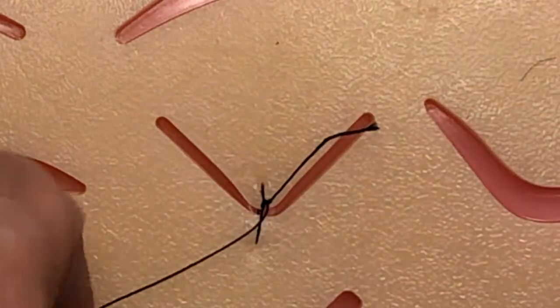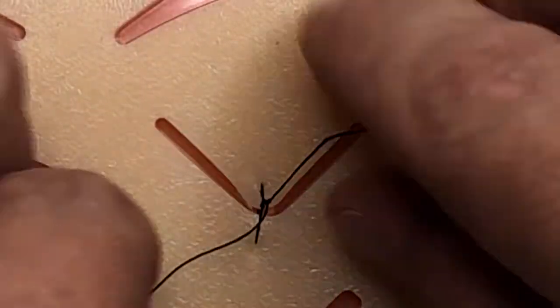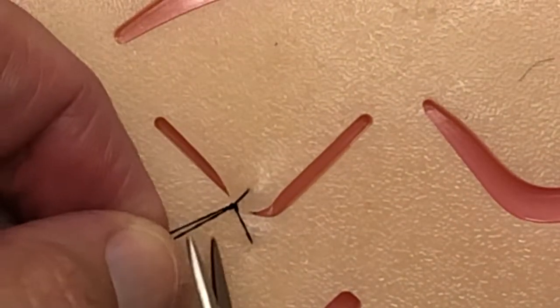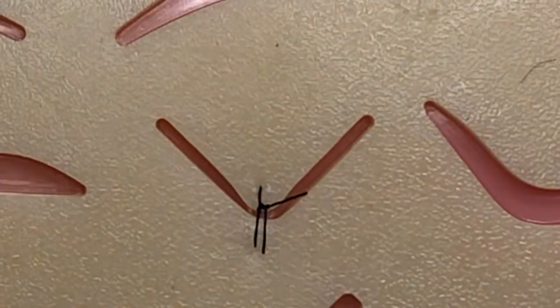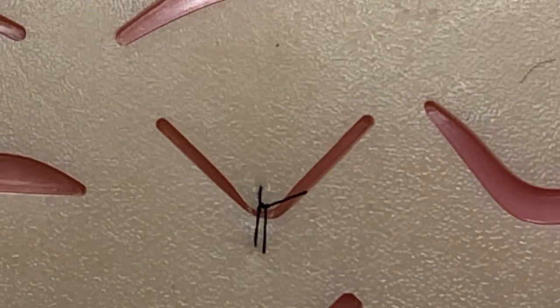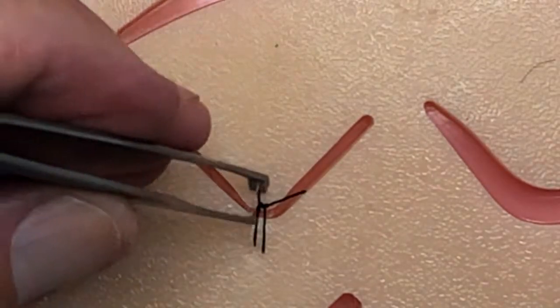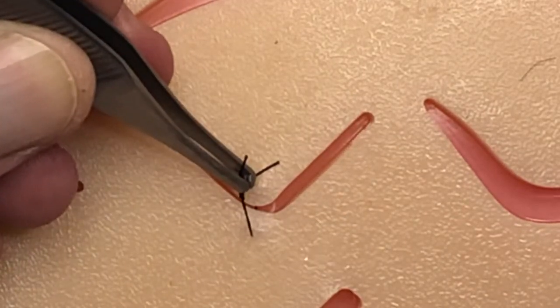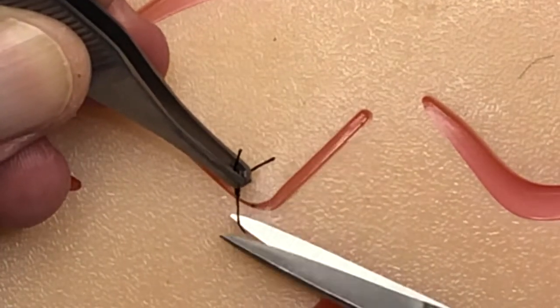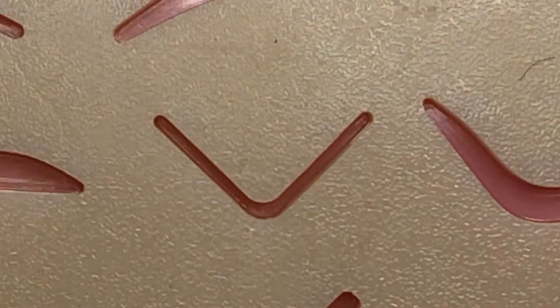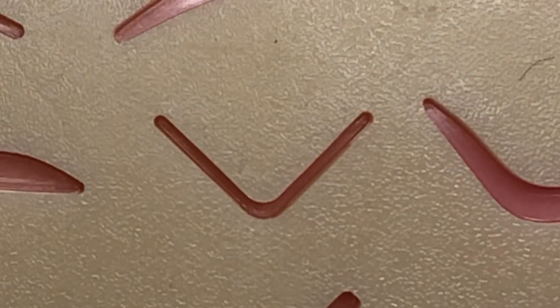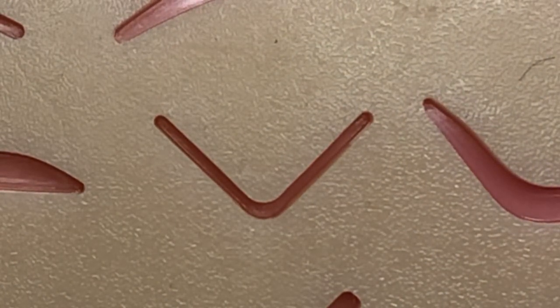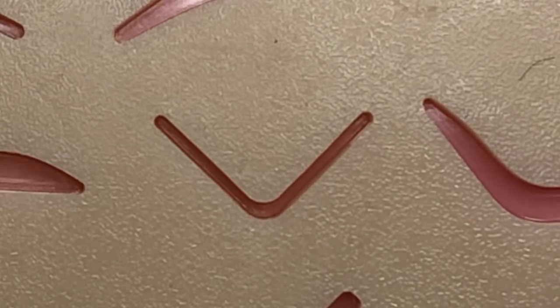And then we're going to snip right there. So you've got your suture. All right, so what we'll do is we're going to come in and we're going to practice removing that stitch. So you can try to grab your knot, lift up the edge, make a little snip, pull it out.